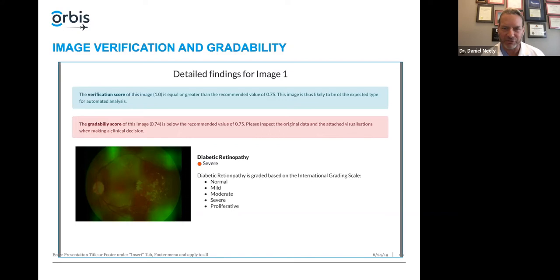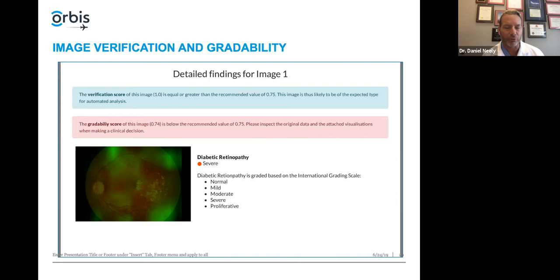Gradeability — this particular image is borderline on gradeability. Gradeability comes down to how clear the image is, what's in the field included. Basically, is this a good image that the AI software can process appropriately? Then the first finding is the diabetic retinopathy score. This was a really ugly-looking image — it had lots of exudates and hemorrhages. The neon green highlighted area shows the whole area is abnormal. In the estimate of the Pegasus software, this fundus image meets the criteria based on the international grading scales to have severe diabetic retinopathy.